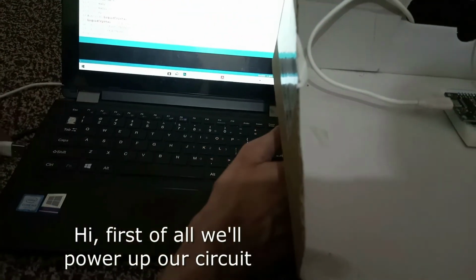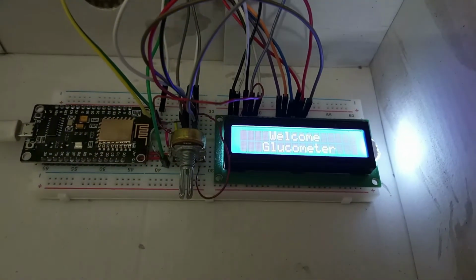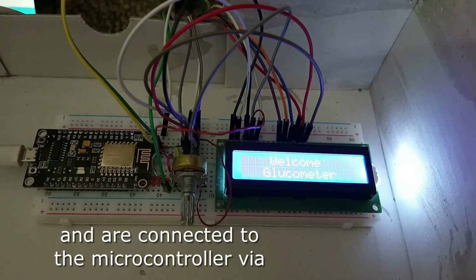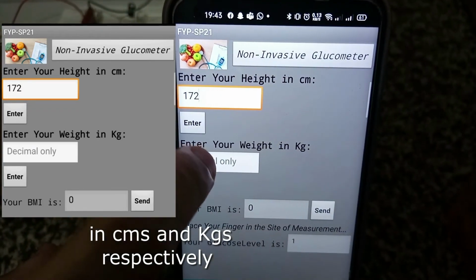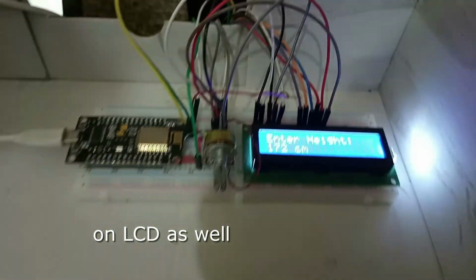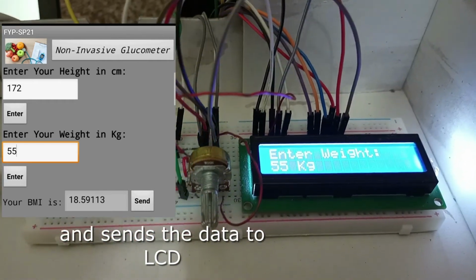Hi. First of all, we will power up our circuit through the temporary connection of a USB cable with the laptop. The circuit and app are ready and are connected to the microcontroller via Bluetooth or Wi-Fi. The user now inputs his height and weight in centimeters and kilograms respectively. The height and weight are displayed on the LCD as well. The app then calculates the BMI, meaning body mass index, and sends the data to the LCD.